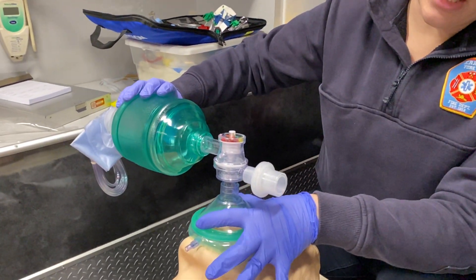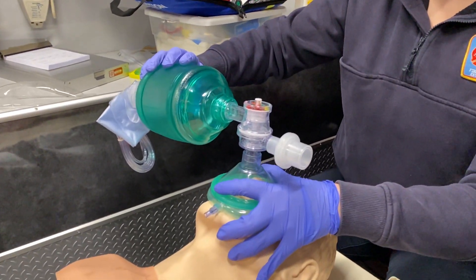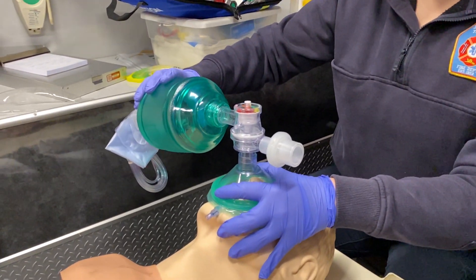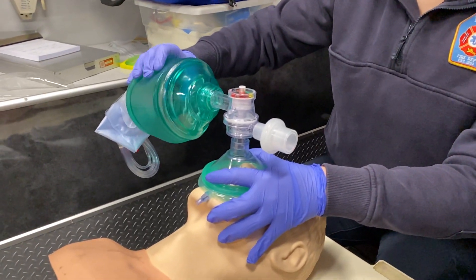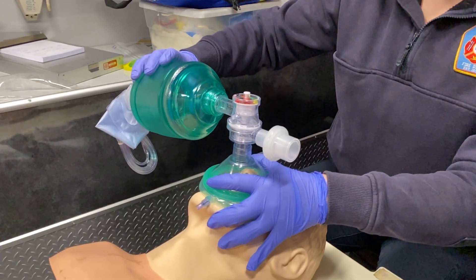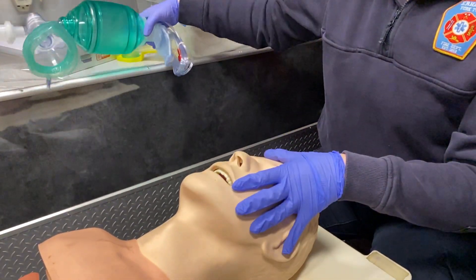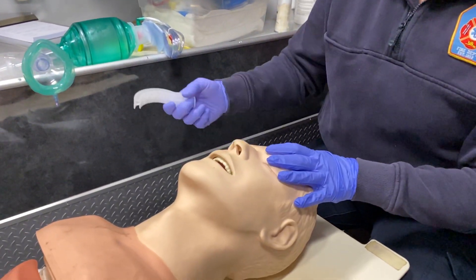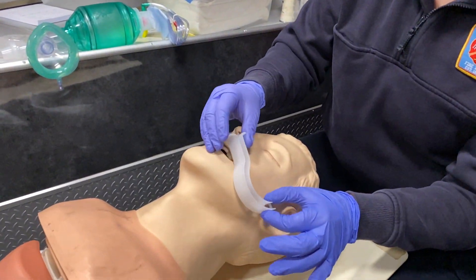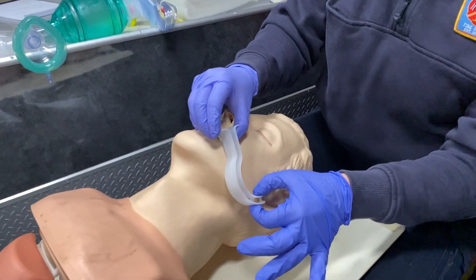Make sure you have a good EC clamp — three fingers holding the jaw, with your thumb and index finger pushing the mask down on the face. For an adult, give one breath every six seconds. We also want to insert an oral airway to ensure good ventilation. Measure the oral airway from the tip of the mouth to the corner of the ear.